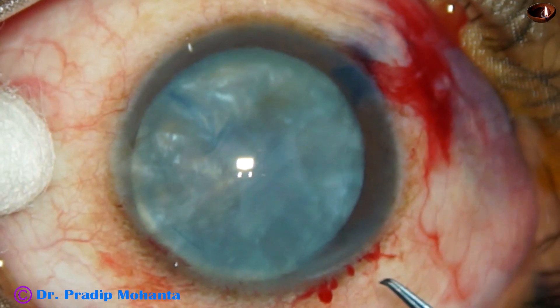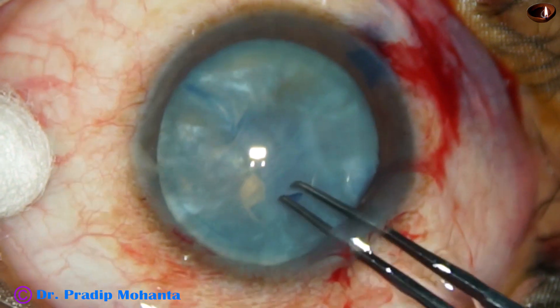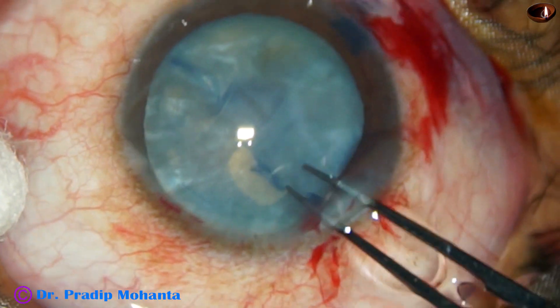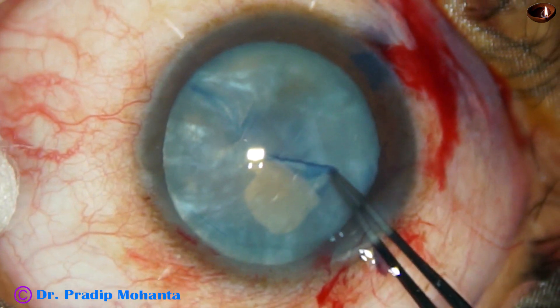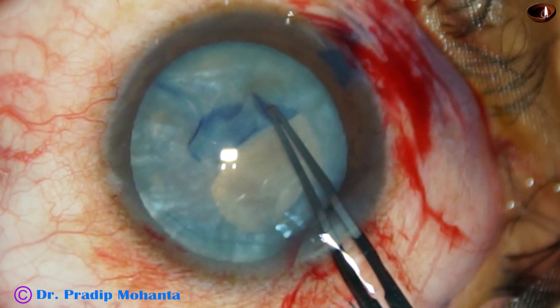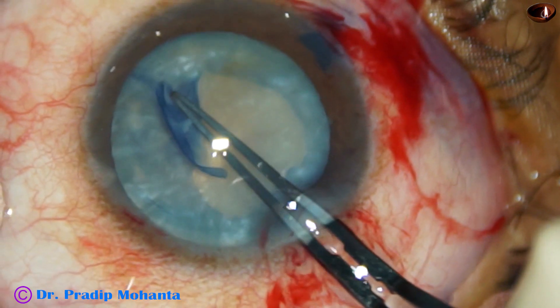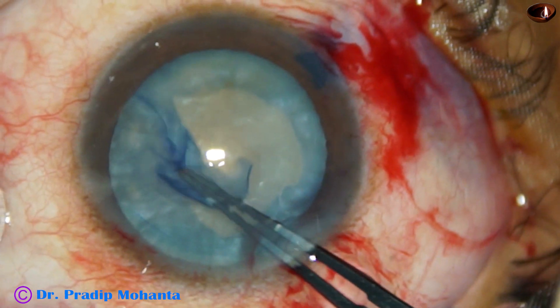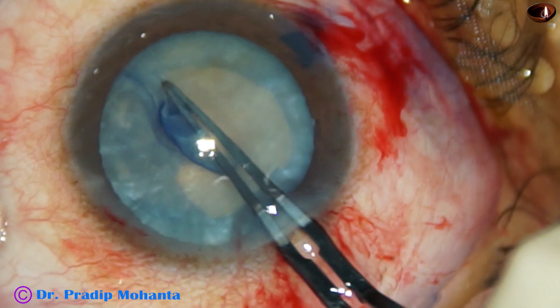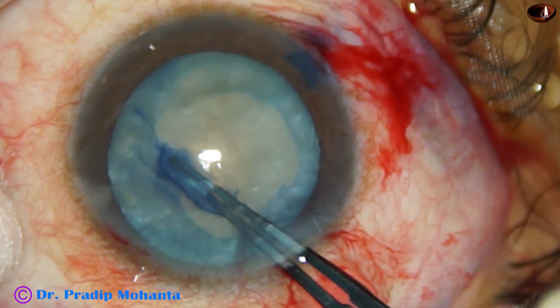Now I take a utrata forceps and my plan is to go around the fibrous tissue and do a rhexis of adequate size. In some places it may go near the margin of the pupil. But here at 4 o'clock the fibrous band goes to the equator, so it cannot go up to the equator and come back. We have to try to bring the capsule back over the fibrosis — and it has come out.